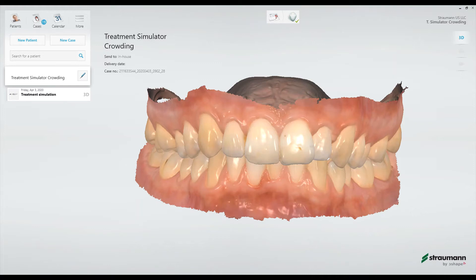Hello and welcome to another 3Shape TRIOS video tutorial. This is Victor Zornetsky, the Strom in Los Angeles Lab Territory Manager. Today we'll be looking at the functionality of the Treatment Simulator app, which is built into the TRIOS ecosystem. This is not included in the TRIOS Basic, but it is included in the TRIOS 3 and the TRIOS 4.